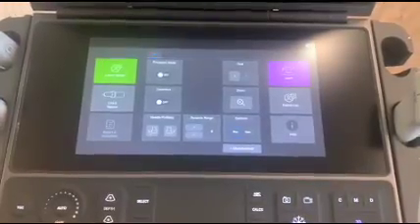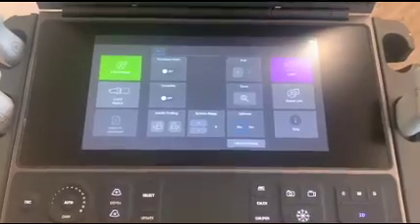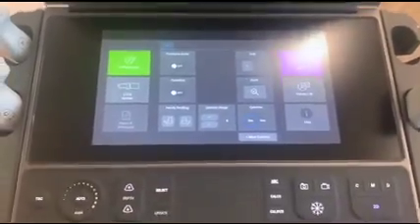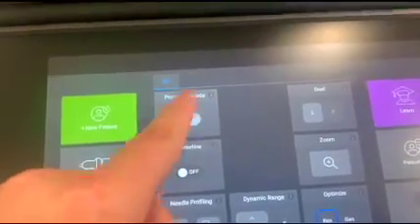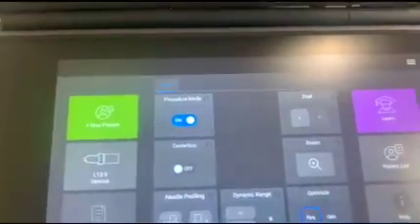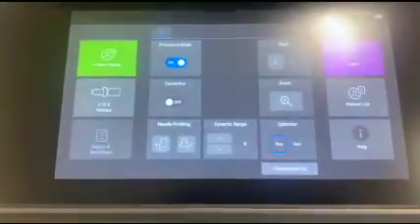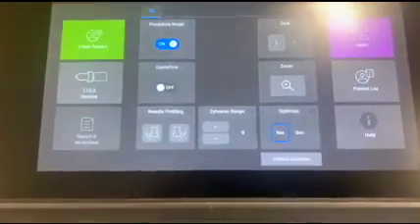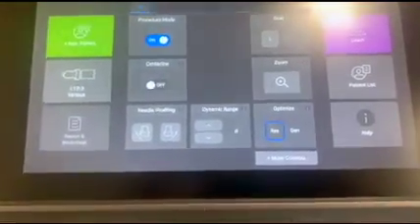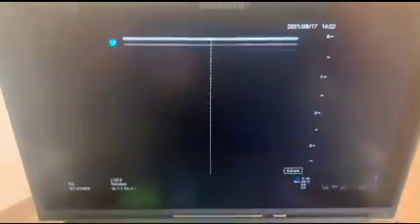There's a few cool features you should know when using the linear probe. If we go here, we can see procedure mode. If you click it, the machine will not go to sleep or turn off during your procedure. If you like using a centerline for orientation, there's a button right here, and the centerline will pop up.